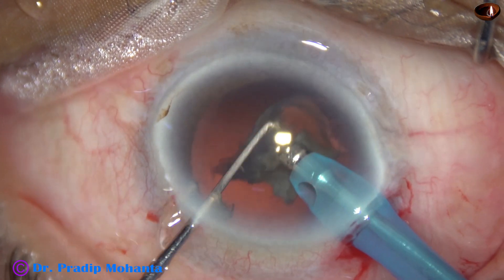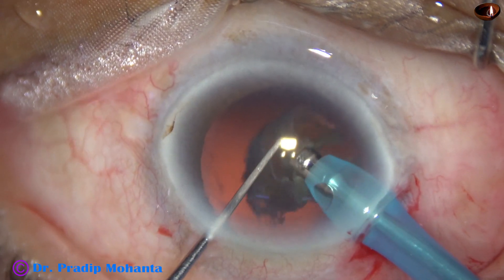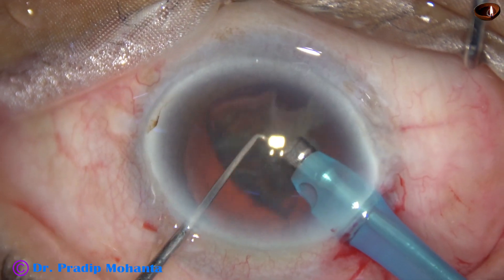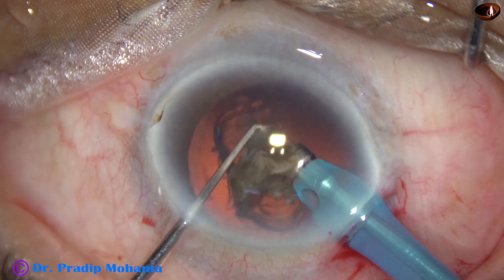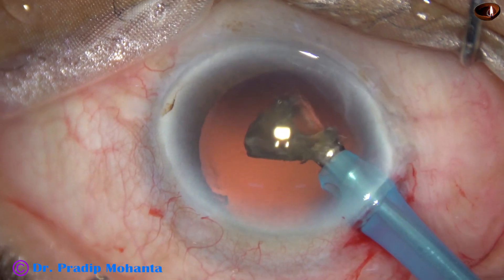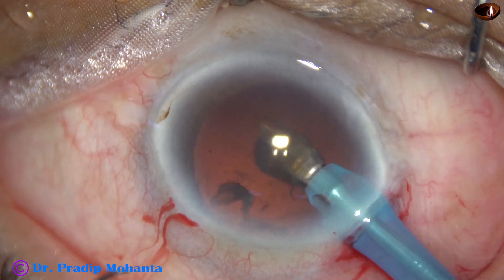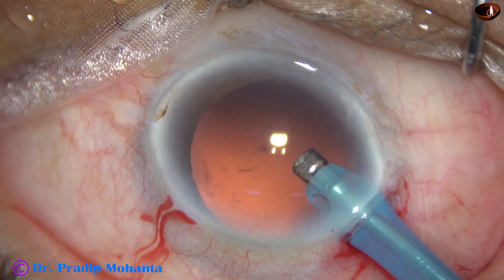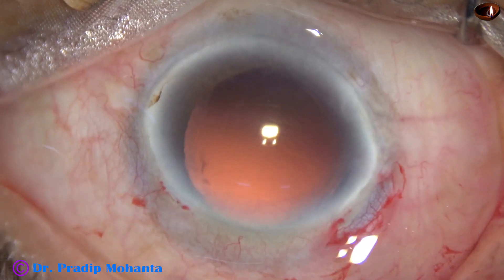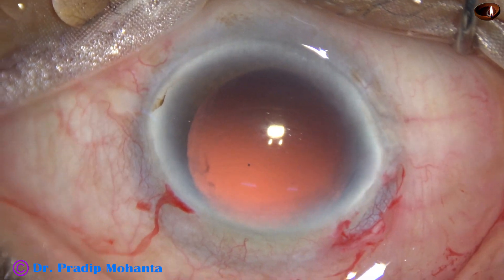One piece is emulsified at high vacuum and high flow rate. During emulsification of this last small nuclear piece, vacuum is reduced to 300 millimeters of mercury and flow rate to 30 ml per minute. And now the chopper is removed from the anterior chamber. Very slowly the last piece is emulsified, placing the phaco needle just at the center, a little bit towards the main wound.